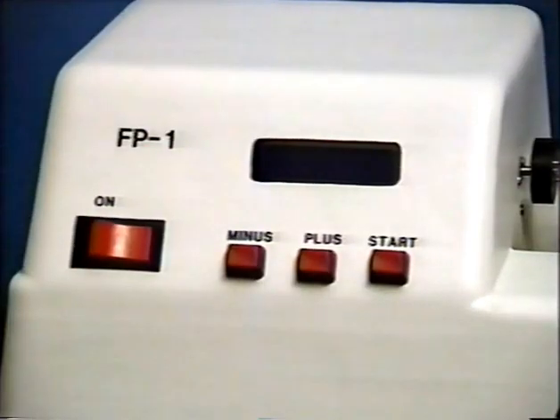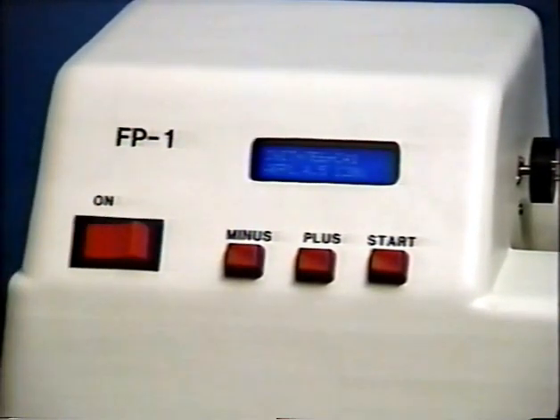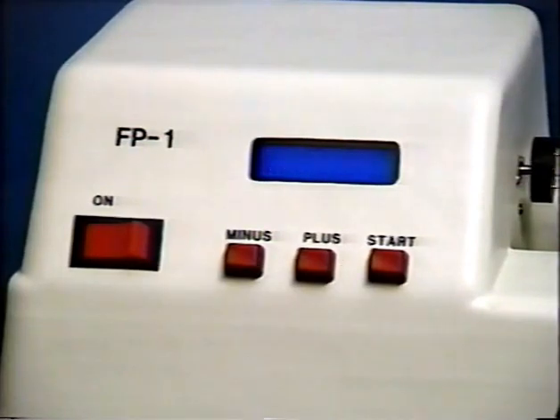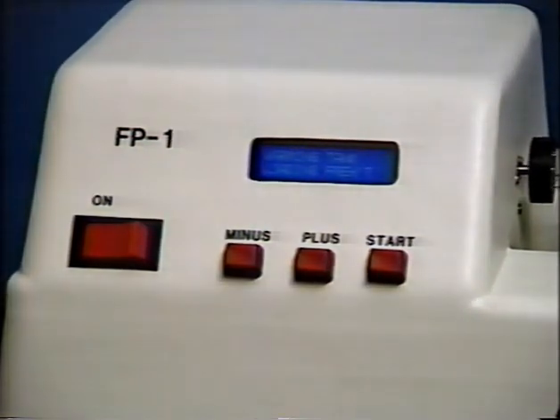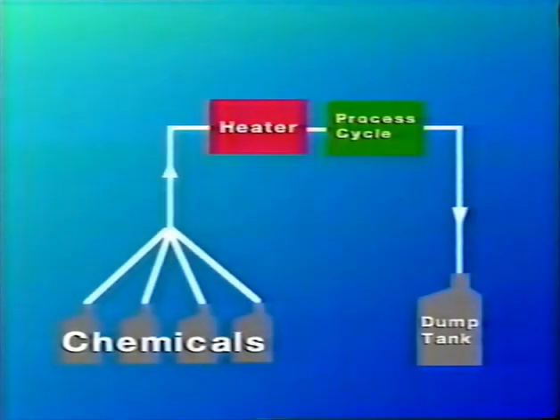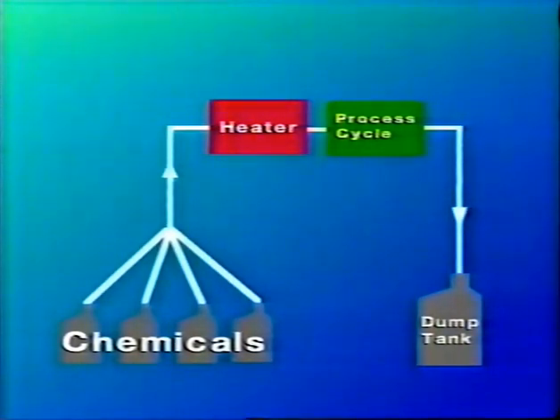Next, turn the power switch on and in a few seconds the unit will initialize, and the LCD indicator will prompt you for the type of film you wish to process. Press the plus button until you see the proper film type indicated, and then simply push the start button to begin processing. There is no need to warm up the processor ahead of time because each chemical, including the rinse water, is heated to the proper operating temperature immediately before it is pumped into the film tank.